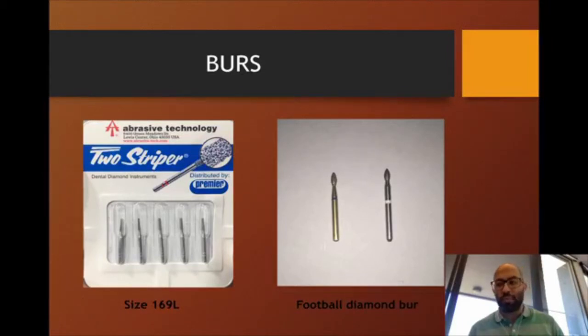I usually prefer to use the blue band for the ADC tasks, because the teeth actually are a bit softer than the natural teeth, and it won't cut much more of the tooth structure.